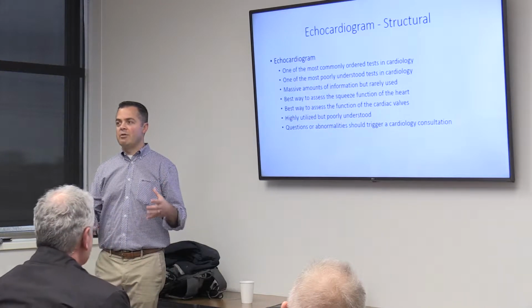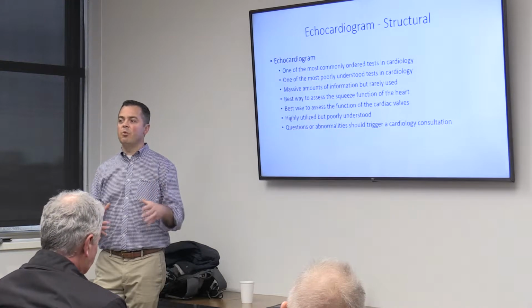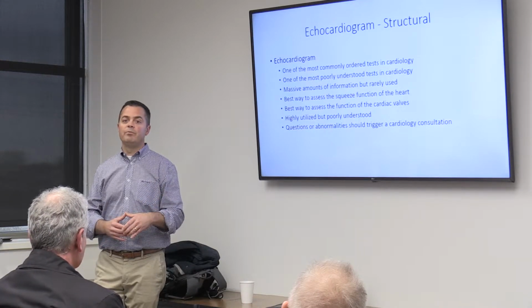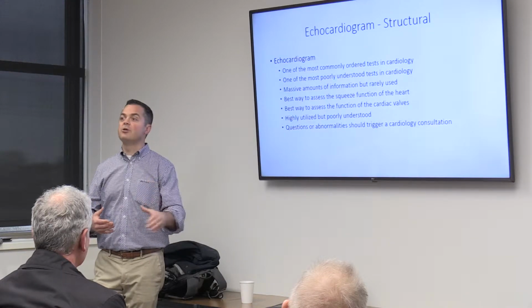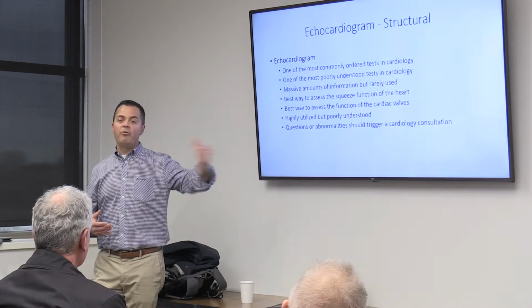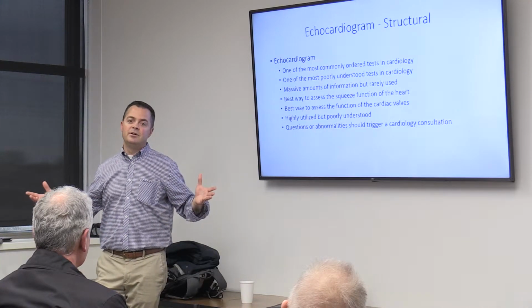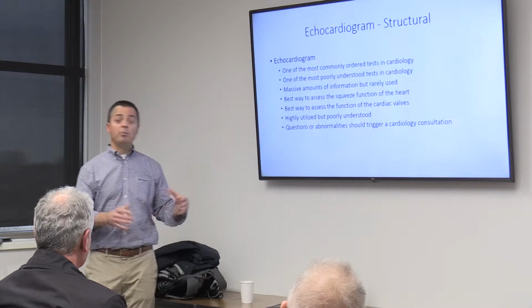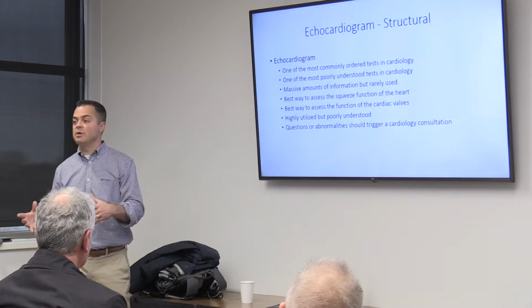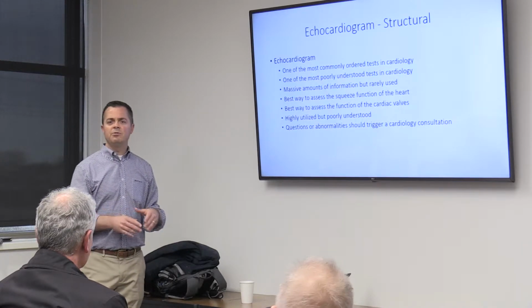So, you have a lot of choices where to get this stuff done. And I think it's important that you understand who's doing it. Because whether you have your echo done here, or small town, middle Wisconsin, or Aurora, or anywhere else, you're paying the same for it. I mean, you want to get quality. You want to get a high quality scan. Because people are going to use this to make decisions. People are going to use this to make diagnoses. So, does anybody have any questions about echocardiograms?